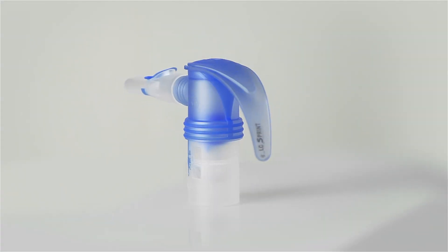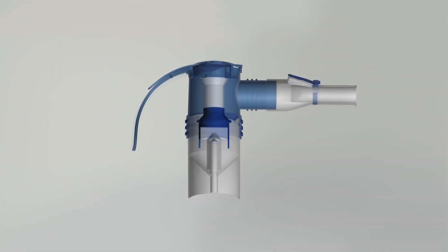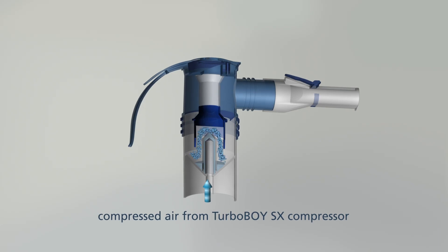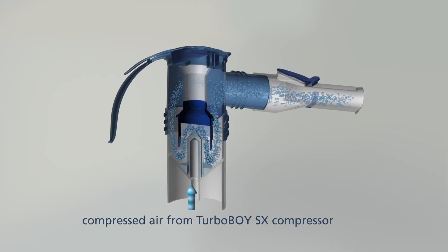The Pari LC Sprint Jet Nebulizer is the centerpiece of your inhalation device. In the nebulizer, the inhalation solution is atomized to produce fine droplets. Whether it contains medications or perhaps just saline solution, this is where the aerosol is made.